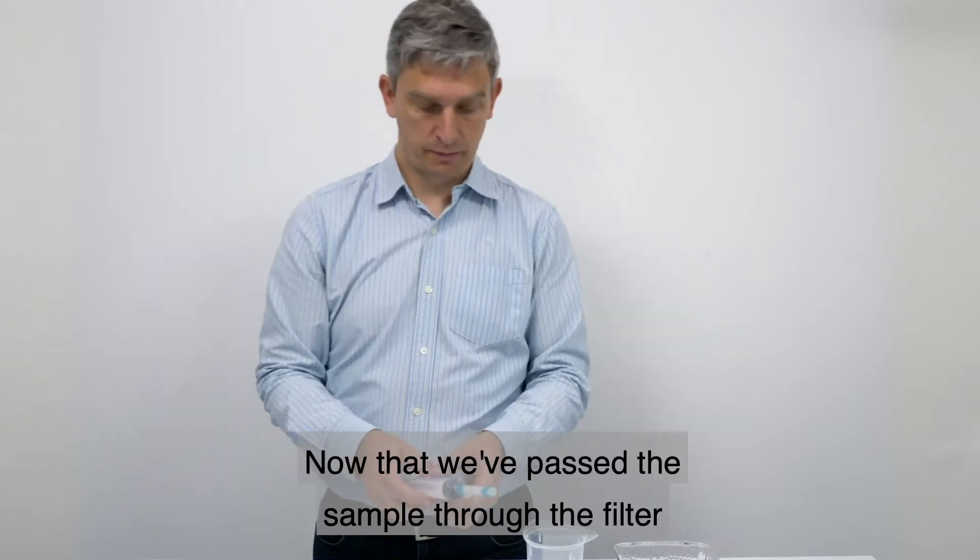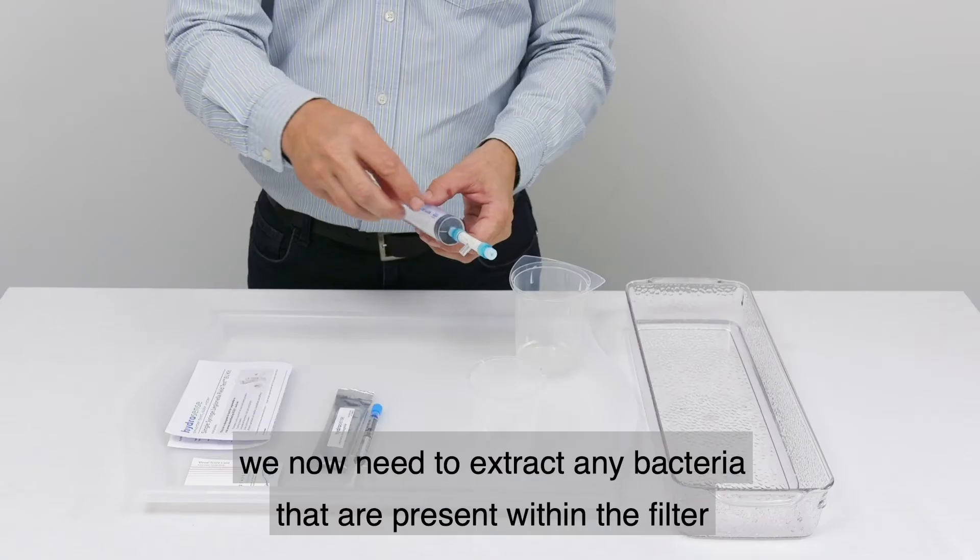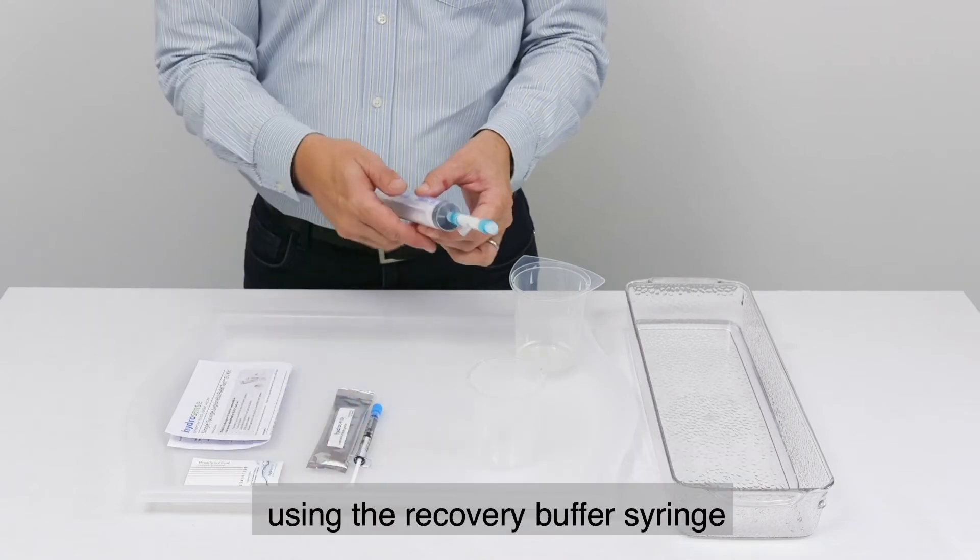Now that we've passed the sample through the filter, we need to extract any bacteria that are present within the filter using the recovery buffer syringe.